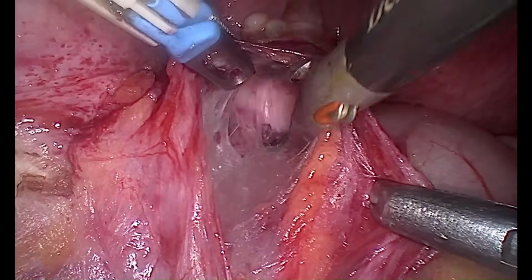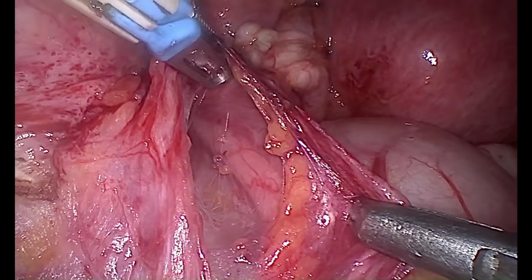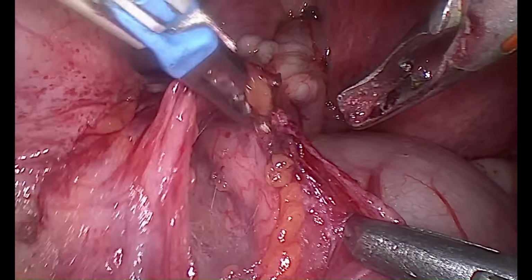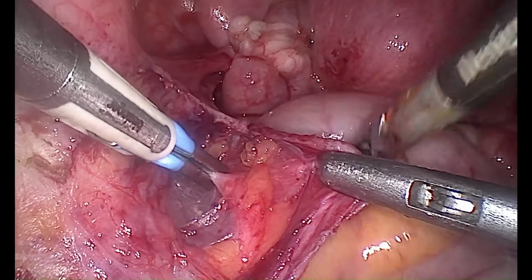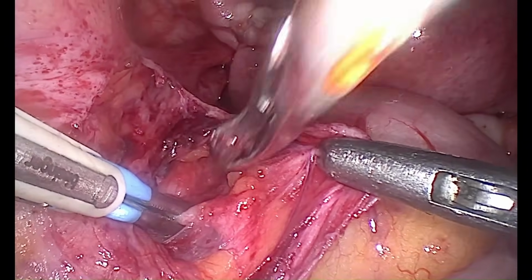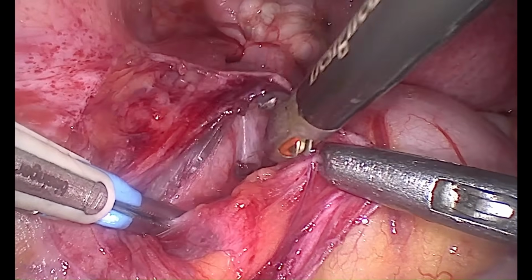Now the ureter is visualized. You can see there is a different architecture of the microvascular capillaries which supply the ureter, and these are the adhesions of the peritoneum. We are showing all of you how to do a ureterolysis when the ureter is puckered in the peritoneum and you need to do a dissection. You can hold the ureter and do the dissection in parallel ways.